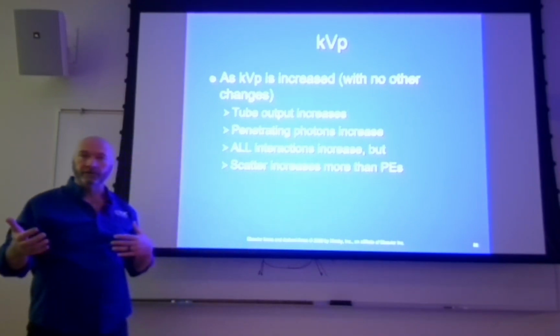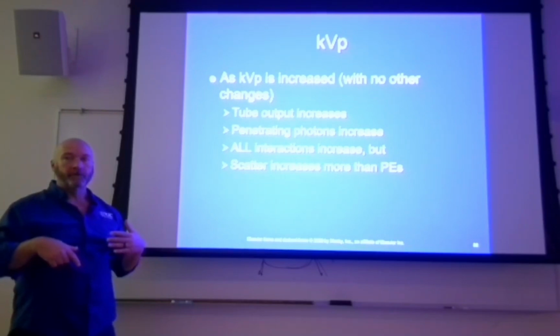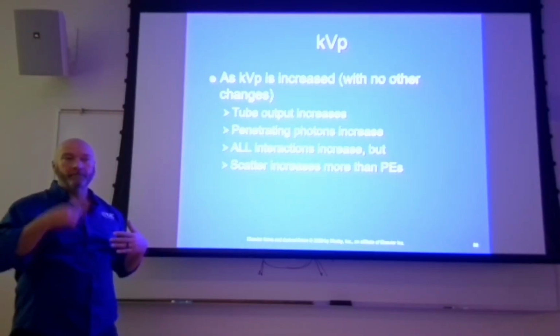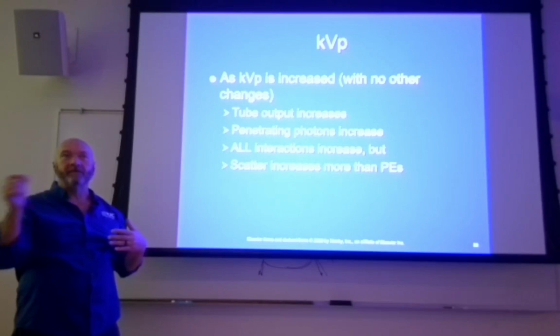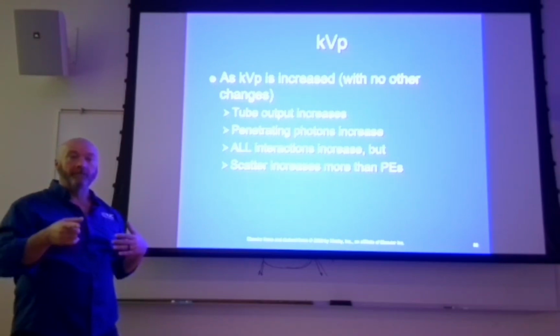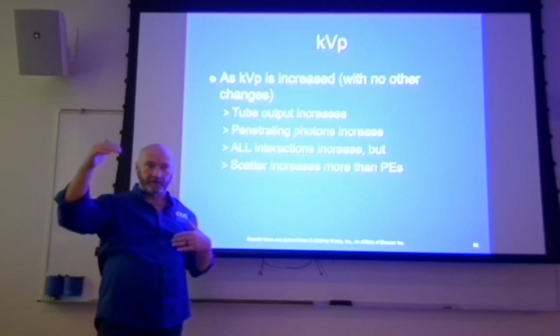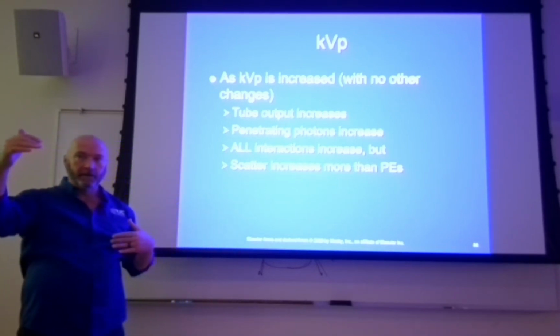So most of those are going to be higher or lower energy? Higher. Okay. So what is the average energy of any X-ray beam? About 1/3, right? So we still create a tremendous number of low energy X-ray photons, right?